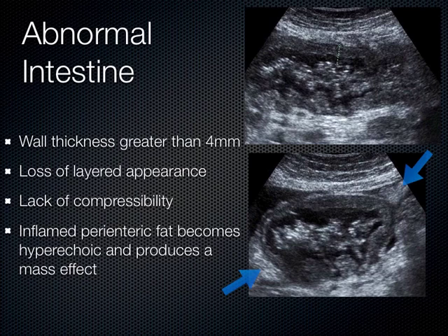And when I compress them, it exudes this mass effect. It all moves together as one unit. Now, intestines should easily flop around each other and slip around each other and should slide amongst one another. When there's inflammation or abnormality there, then it all moves together like a unit. And this is an example here of a patient who had pseudomembranous colitis.